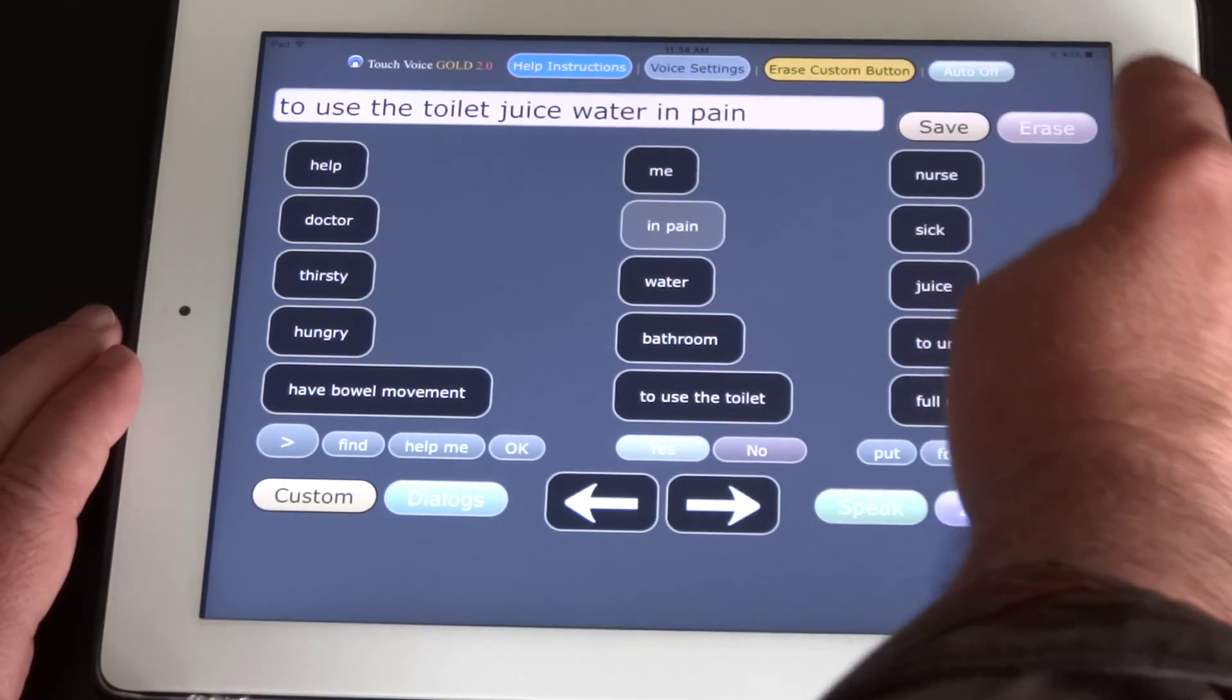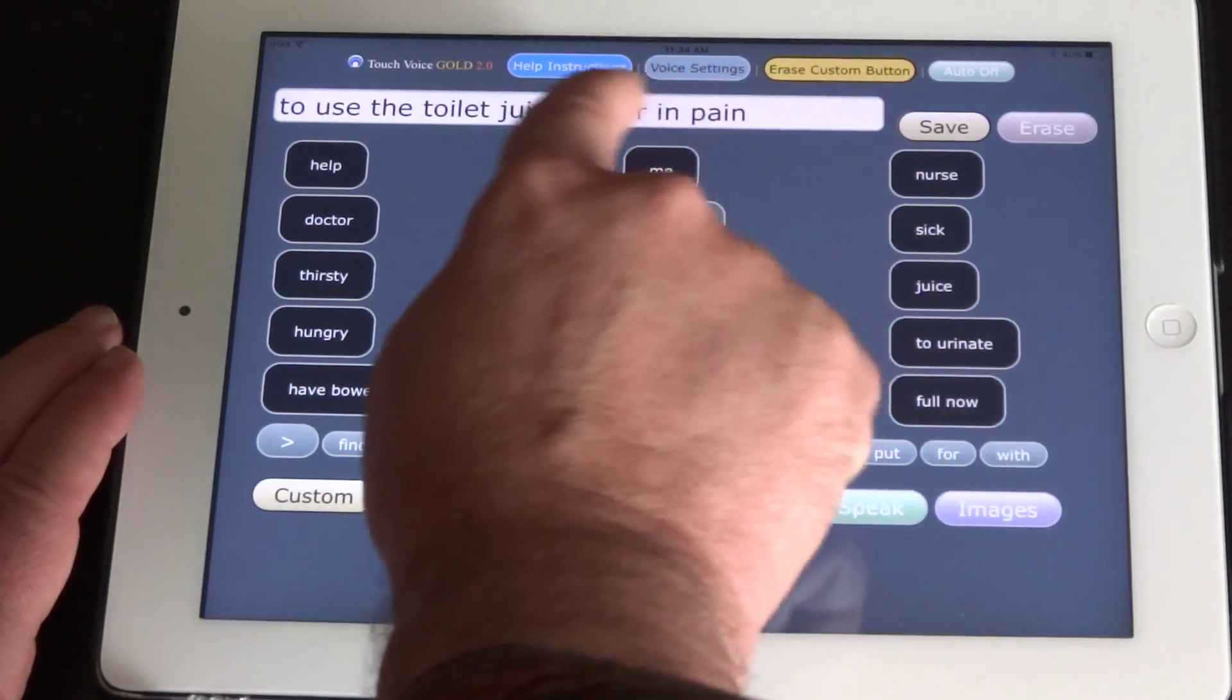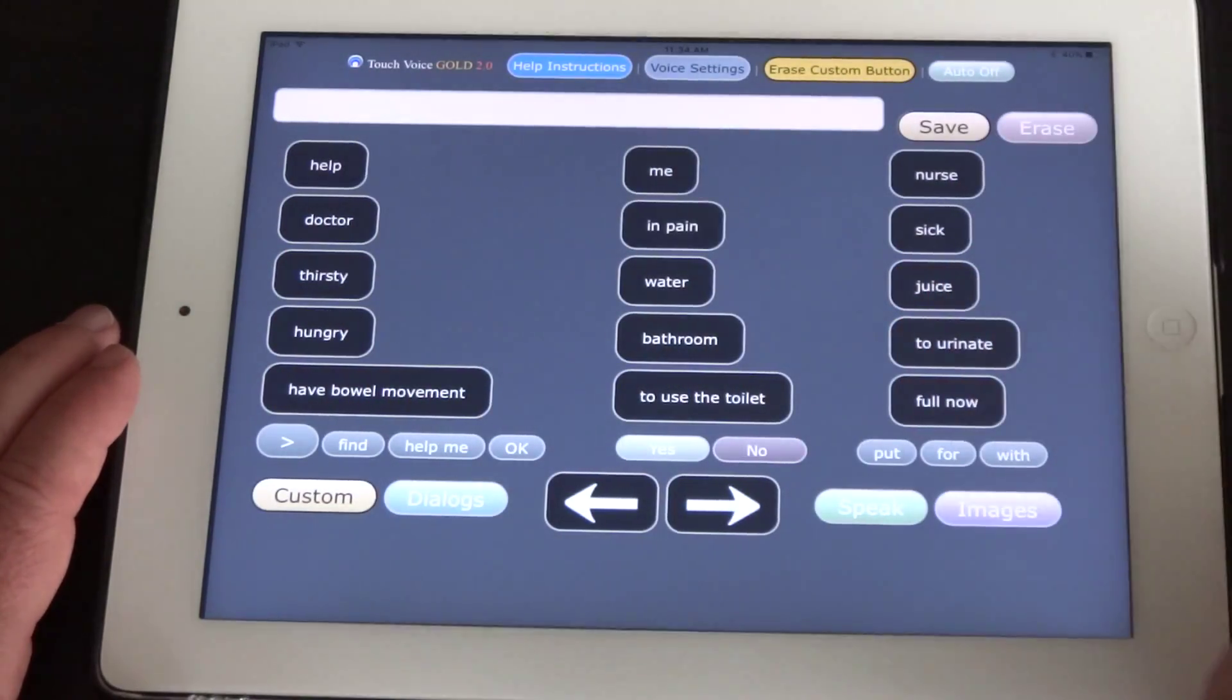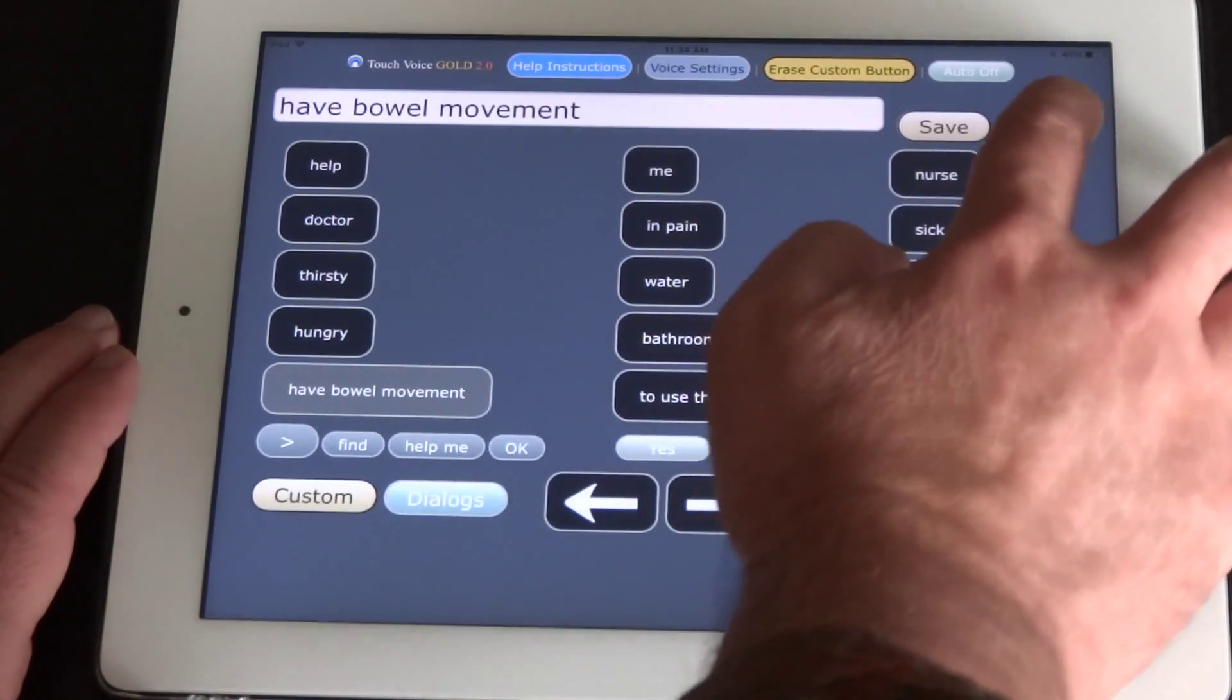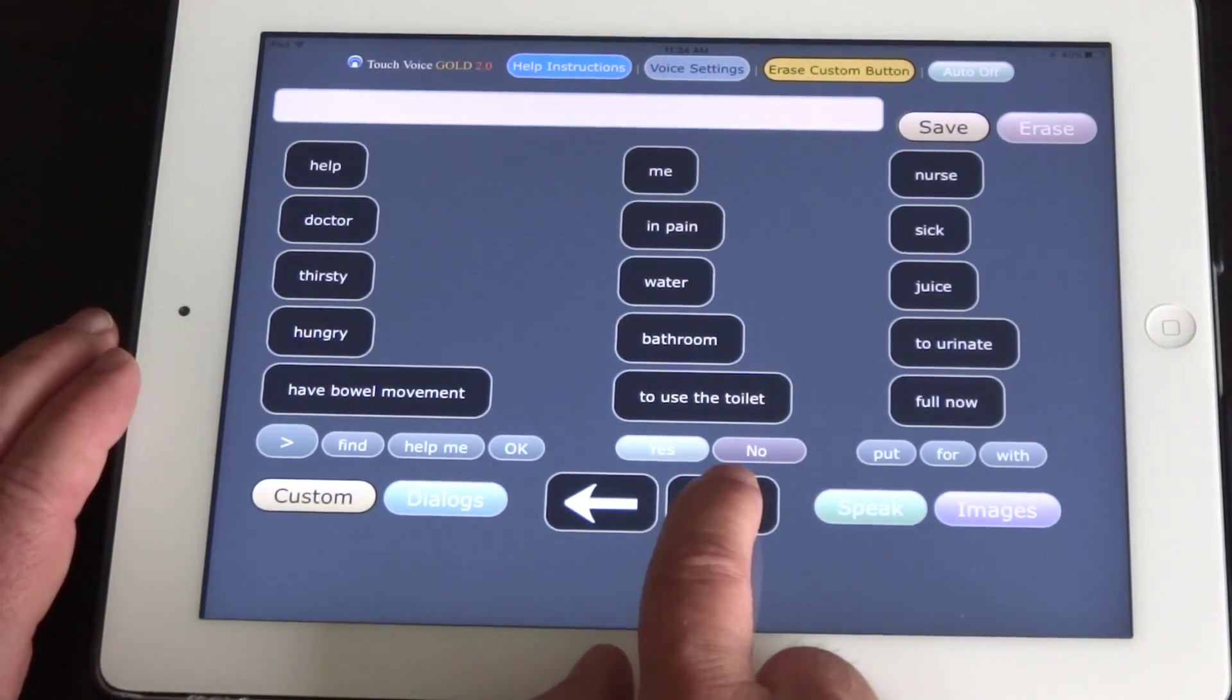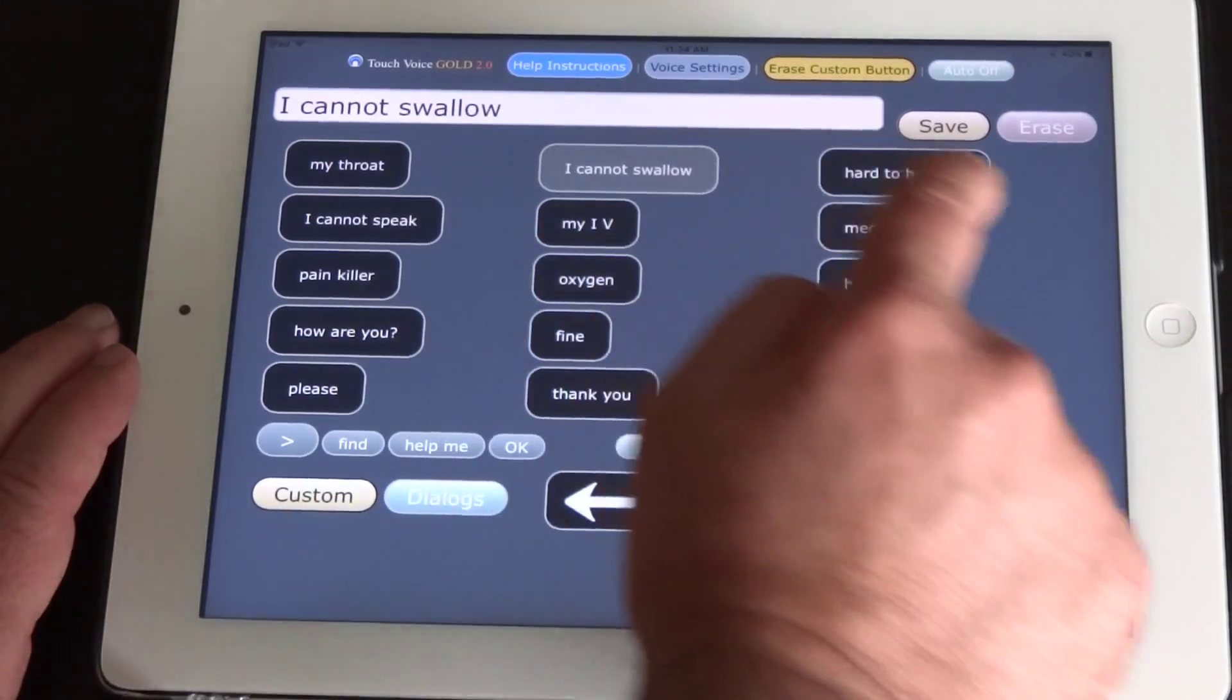In pain. You can erase the speech line up here by pressing the erase button. Have bowel movement. And then you use these arrow keys down here to page through the word phrases.